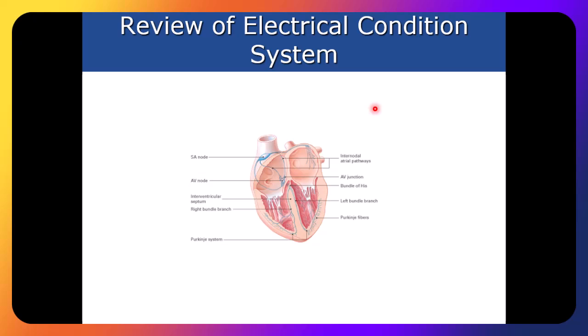Think of your normal conduction pathway and now compare it to starting at the junction and going backwards. Your ventricles are going to fire. Well, it could be, because that may be why we would see that P wave after the QRS. But I'm talking about the mechanical action of the atria. Well, probably not. It's not going to be doing as good as it was.